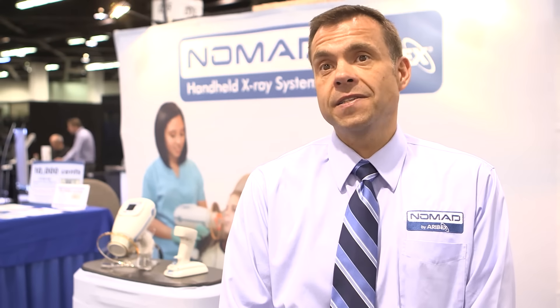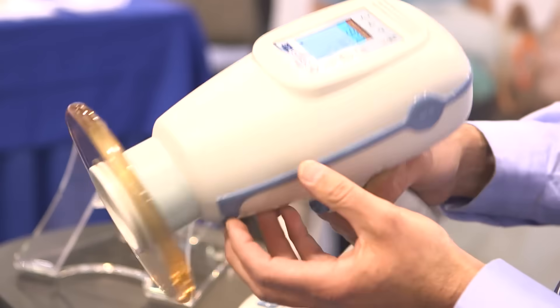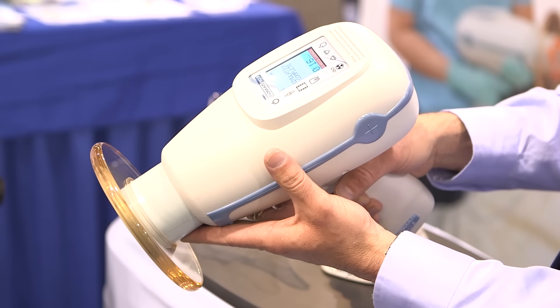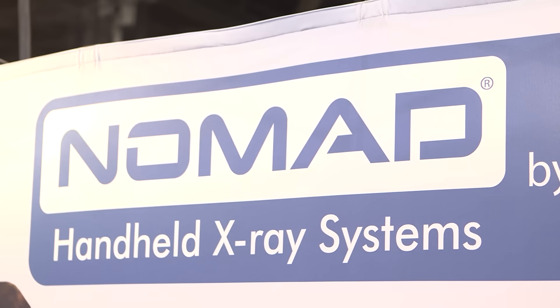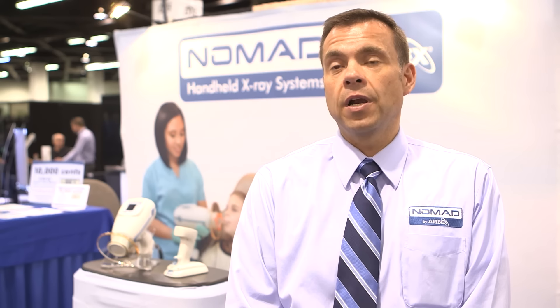Another key benefit to this device is it can go operatory to operatory. So with one Nomad, you can service two to three operatories. And another benefit is the out-of-office use. With its mobility and portability, you're able to take the Nomad out into the community. You see a lot of the Give Kids a Smile events and a lot of humanitarian events where it's become very useful and practical.